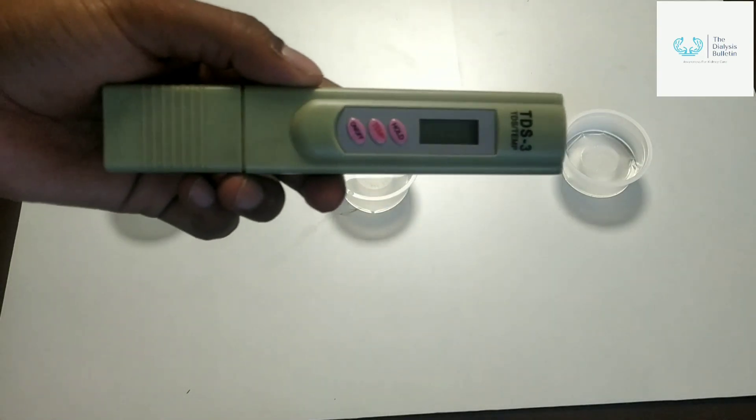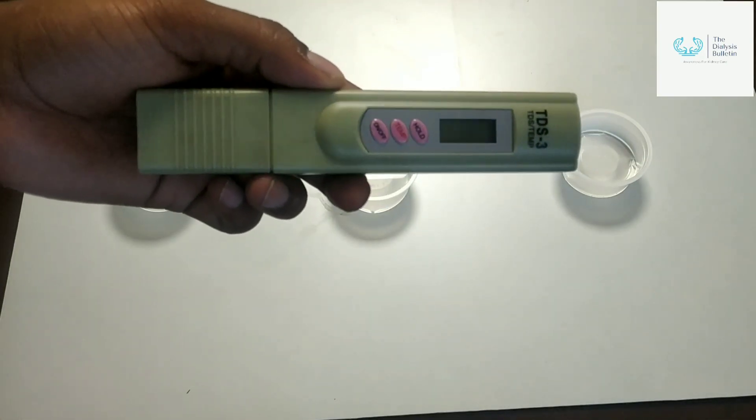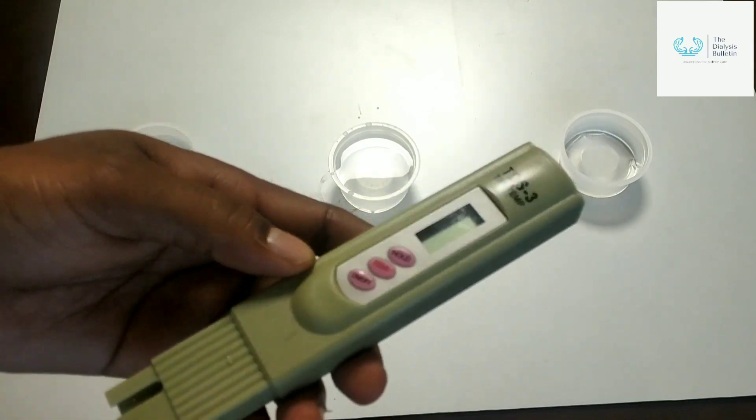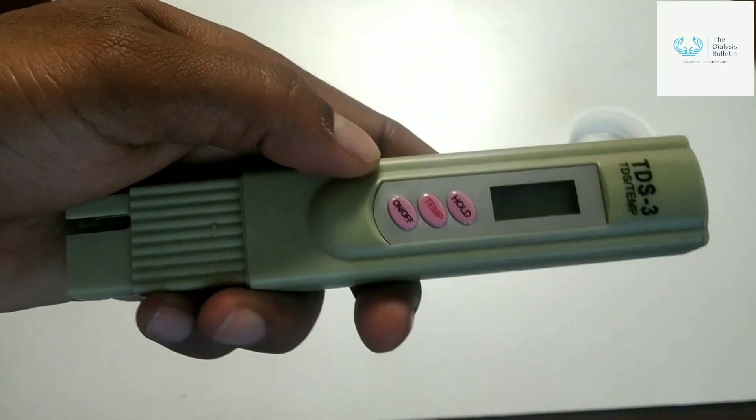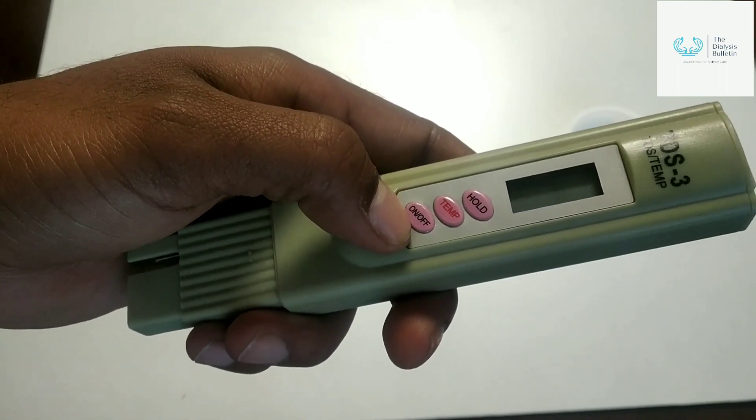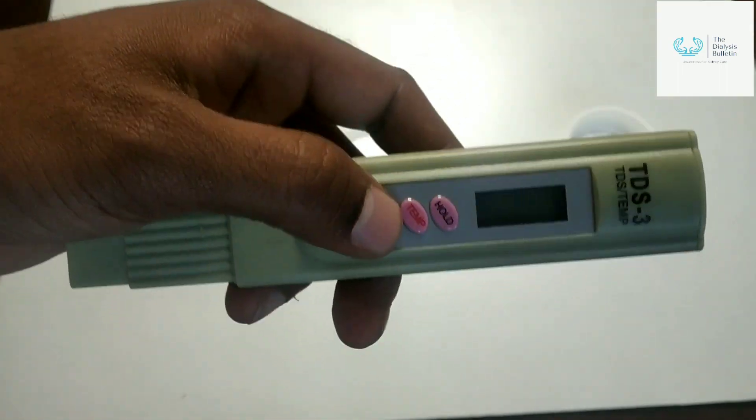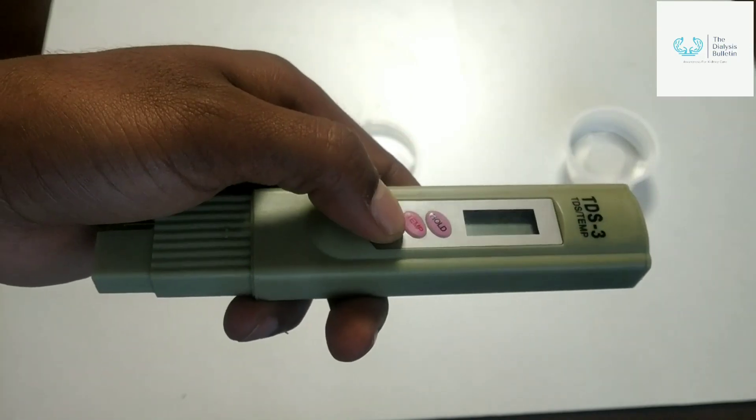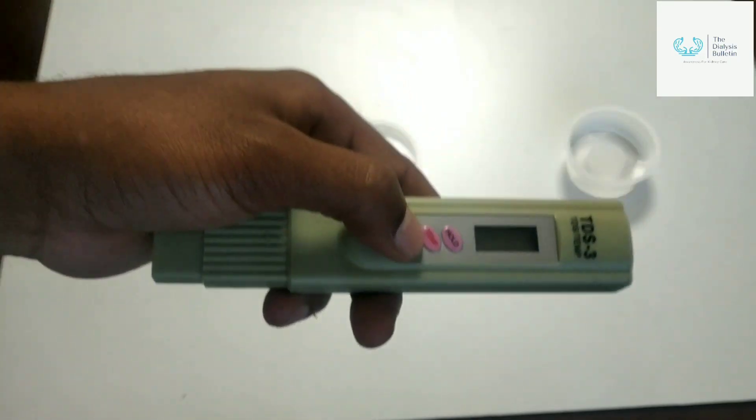For that we need a TDS meter like this. There are three functions over here: one is hold, second is temperature, and third is on/off. When you check the TDS of the water, you should start over here.